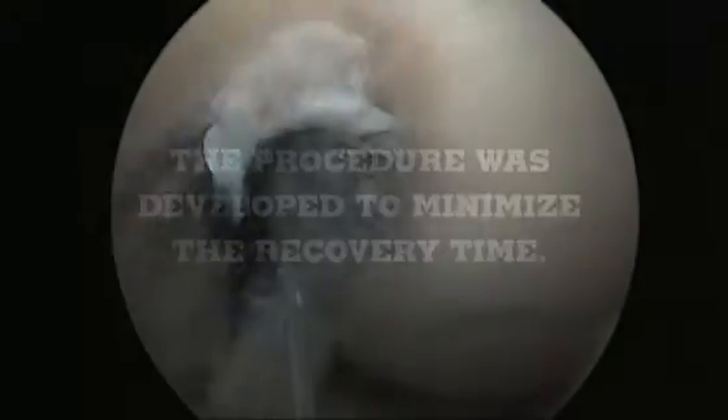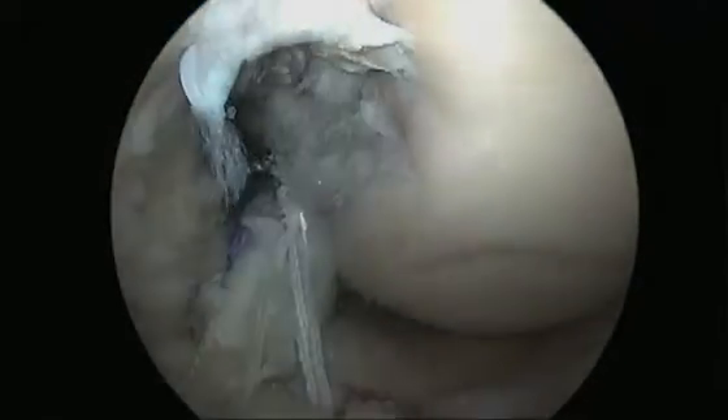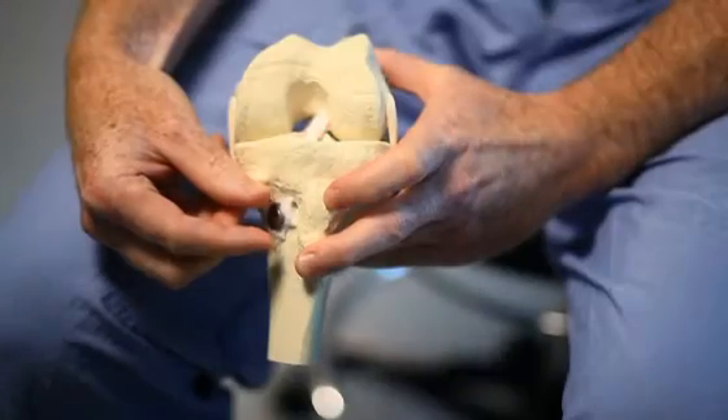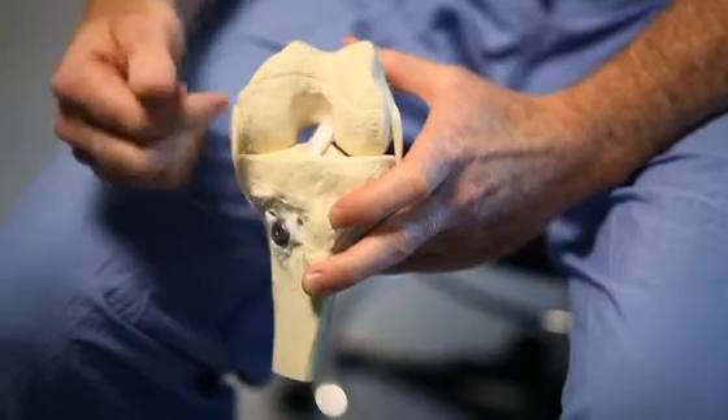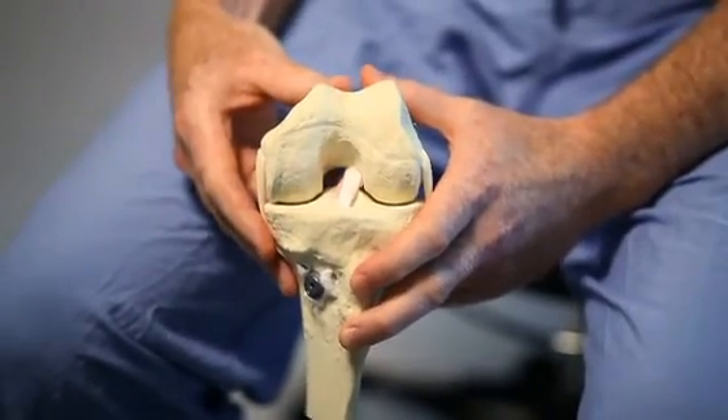These ACL reconstructions, including this double bundle reconstruction, are done arthroscopically. Typically what you see with this type of procedure is a small incision right up on the top part of the shin bone, and then three little pokes from the knee arthroscopy, which is how the technique is actually performed.